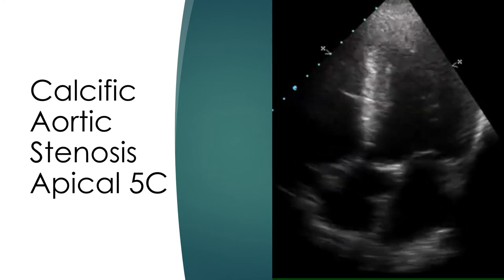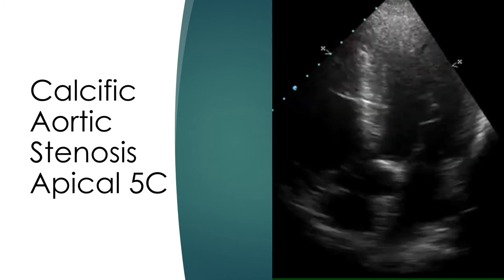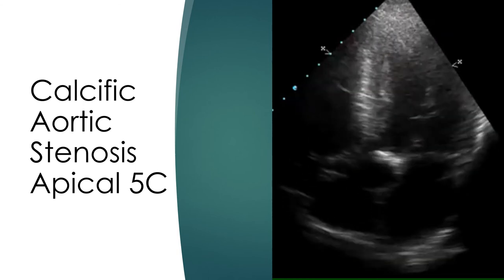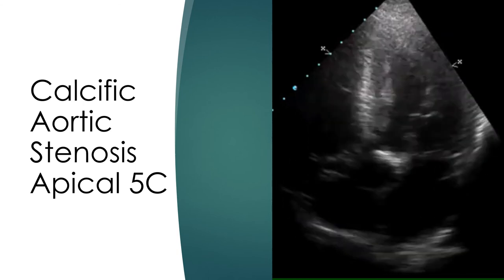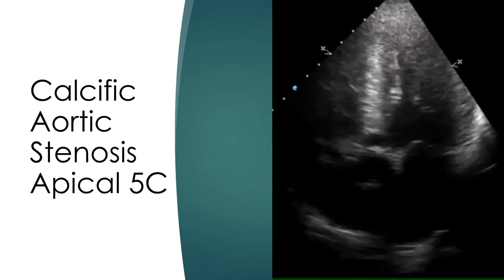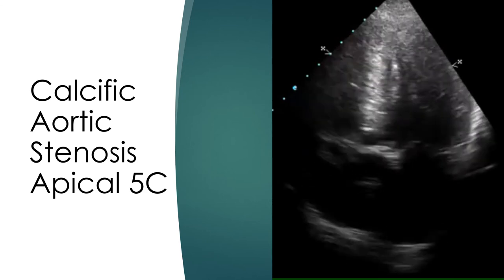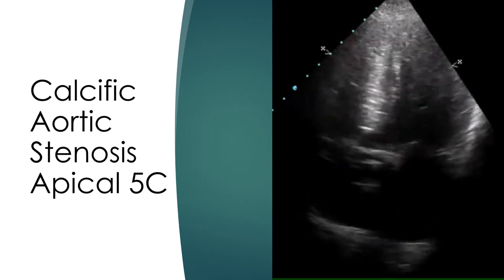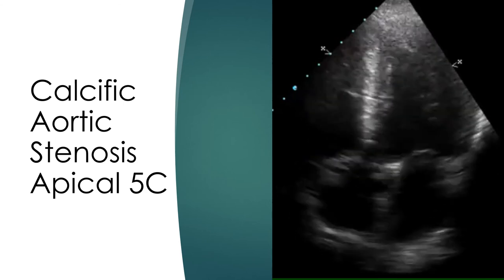Apical 5-chamber view showing the thickened aortic valve. This is the usual view used for estimating trans-valvar gradients as the Doppler beam is parallel to the jet in this view.